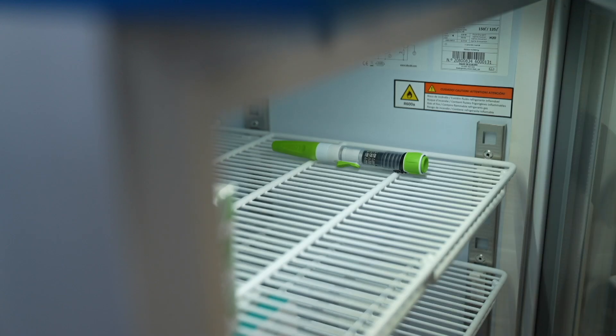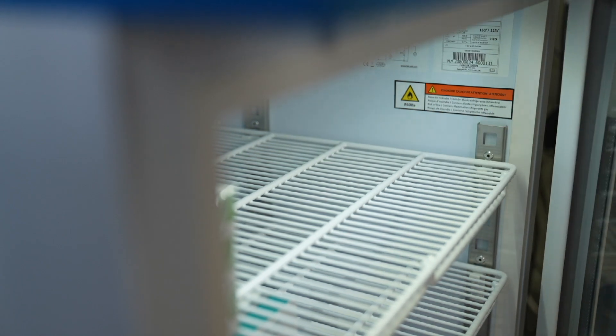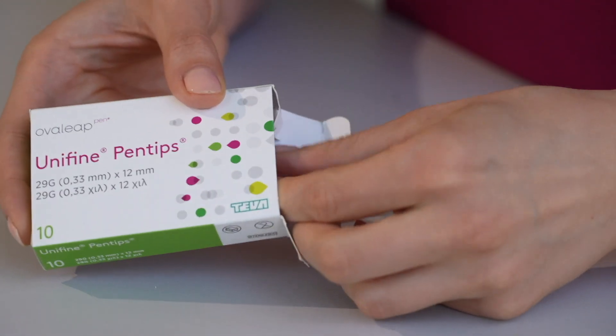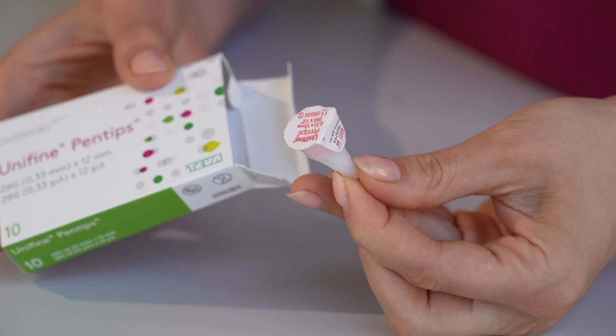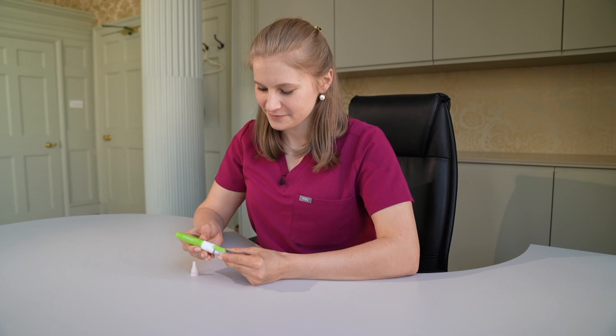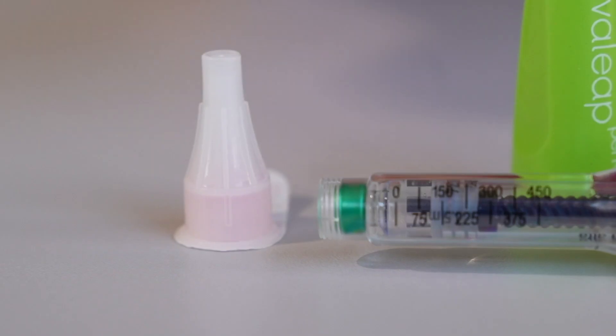Start by assembling the equipment. You will need the pen device, which has already been stored in the fridge — as by this stage it should contain the medication — and a needle, which is in the medication box. Remove the green cap from the pen device. Take the needle, remove the seal and screw onto the pen.